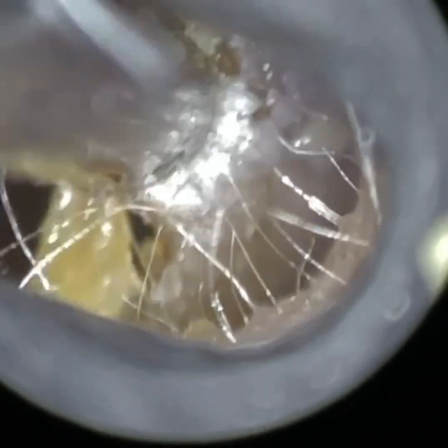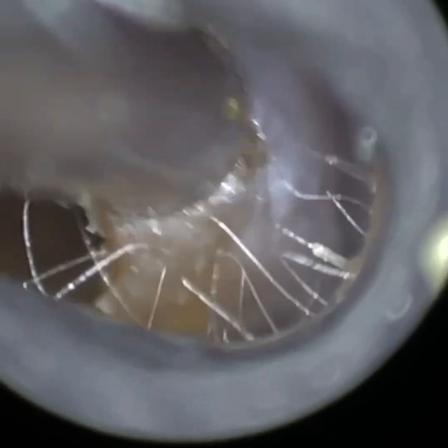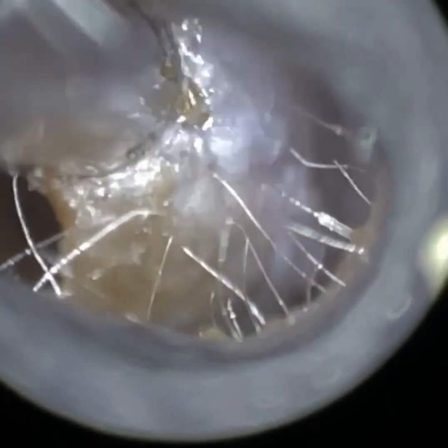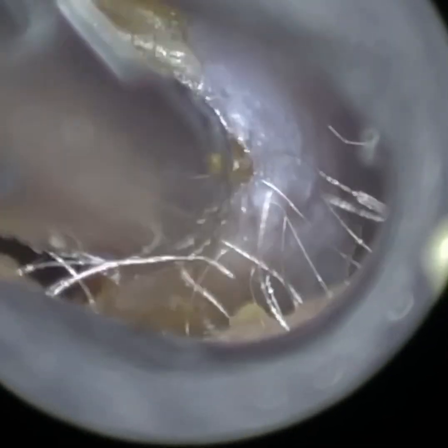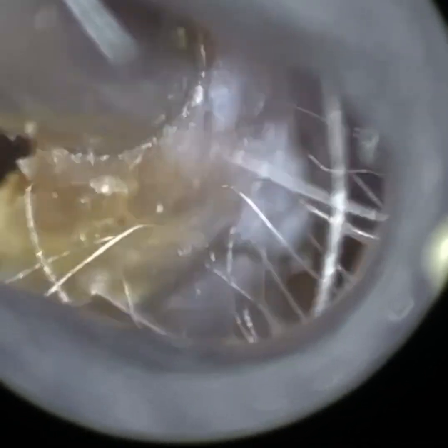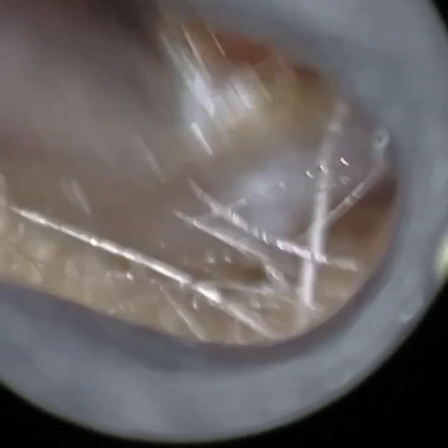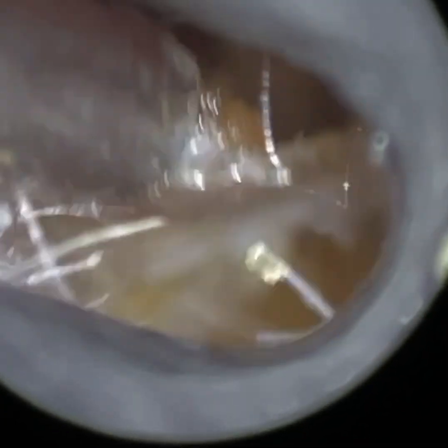They both agree that when you're working really deep in the ear, especially in a case like this with a narrow ear canal and removing wax off the eardrum, binocular vision kind of goes out the window. No matter how advanced the microscope or certain loops are, you simply cannot converge the eye artificially close enough to visualise wax or dead skin off the eardrum. You can see the clarity we've got here — the magnification is great. We're also working on enhancements to the app, including a zoom function, which will be a good additional feature.